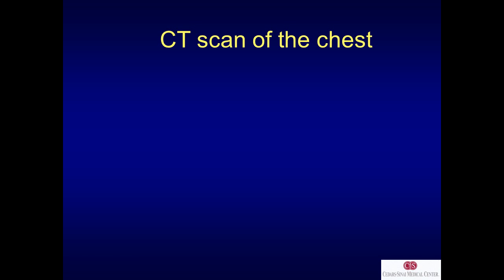So what? Well, this is by CT because many years ago, when this was certainly a more frequent problem, we saw that when by CT you had complete occlusion, almost 80% of the time you can actually pass a wire and dilate. So the complete occlusion by CT is not something that should sort of deter an attempt at dilatation, because a CT total occlusion may not be a complete occlusion. Yes. There could be a chance. Mm-hmm. And the 90% was there.